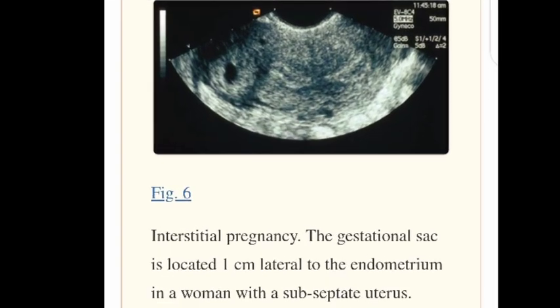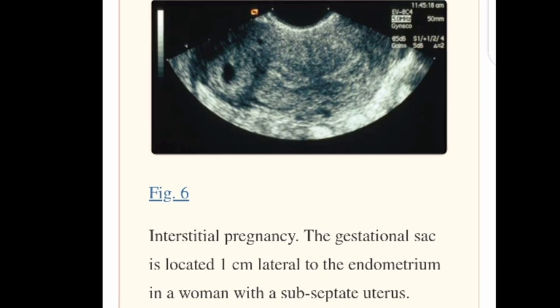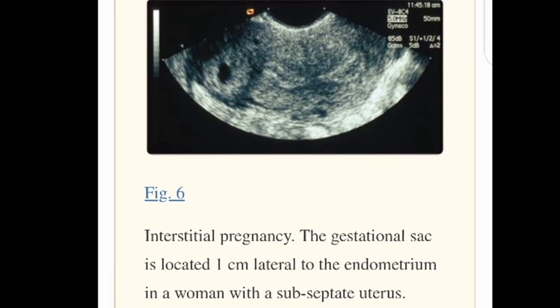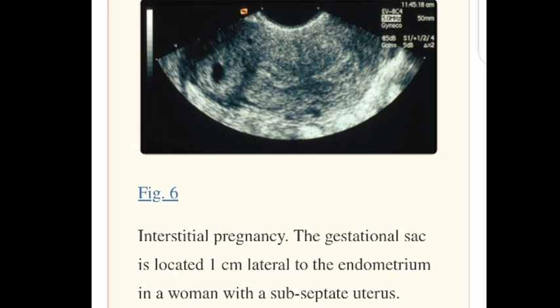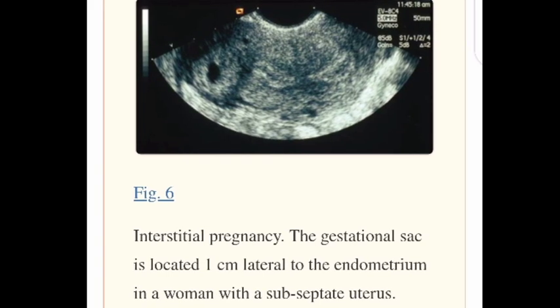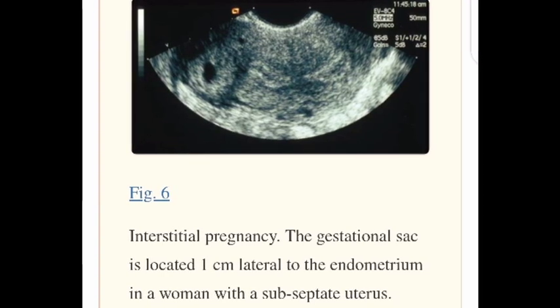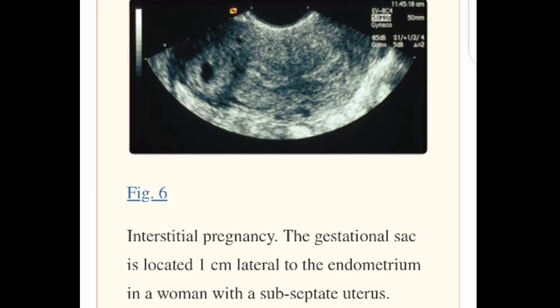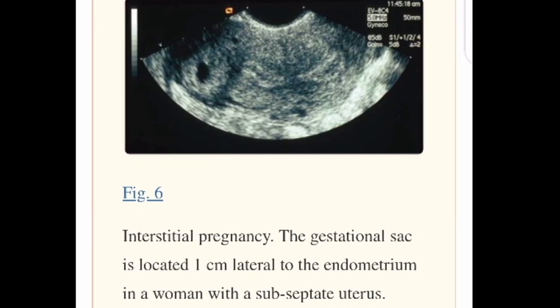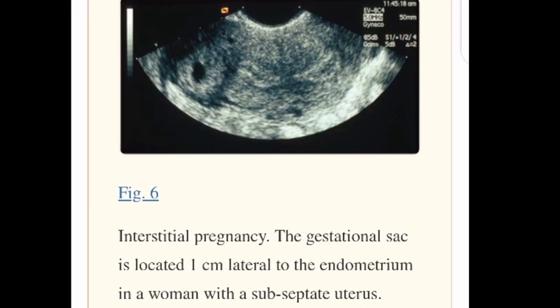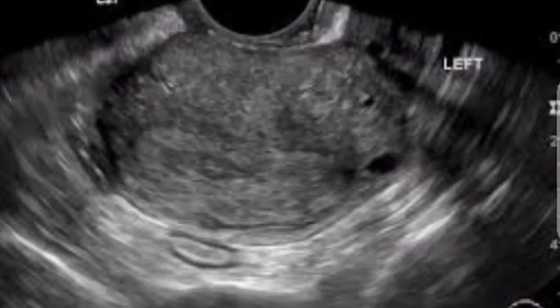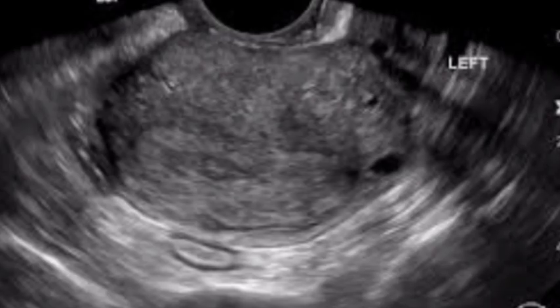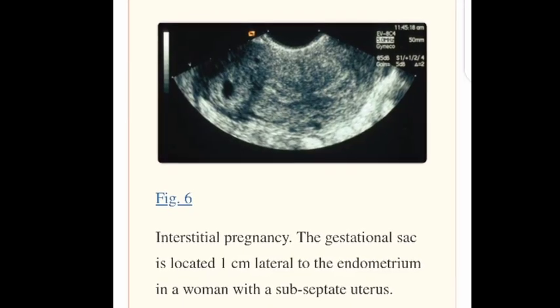1. Interstitial pregnancy. Ultrasound diagnosis is based on the absence of an intrauterine pregnancy, with the presence of trophoblastic tissue located outside of the endometrial cavity — that is, in that part of the fallopian tube which traverses the myometrium. Interstitial pregnancies are surrounded by a thin myometrial mantle, or continuous rim of myometrium.